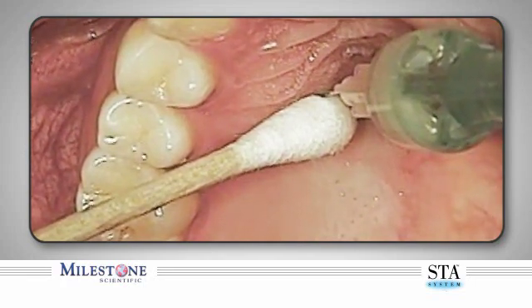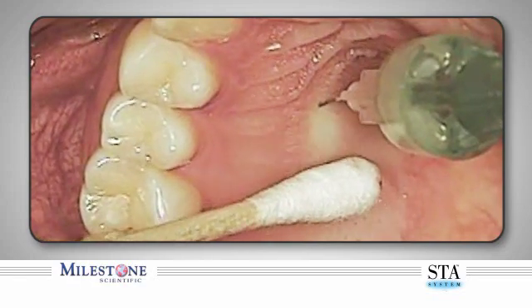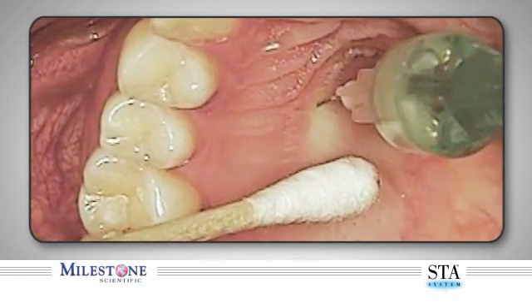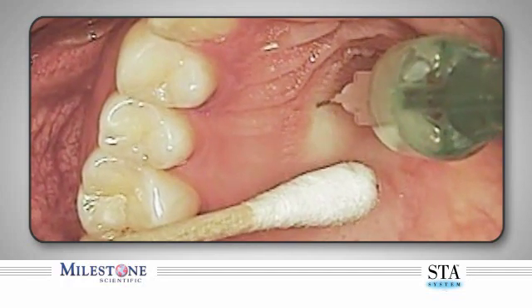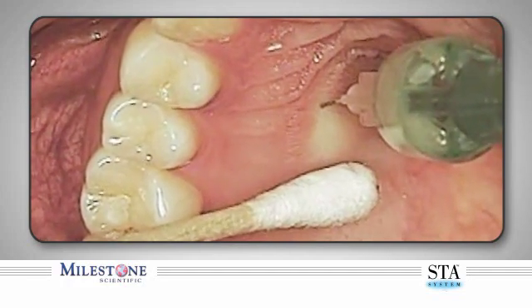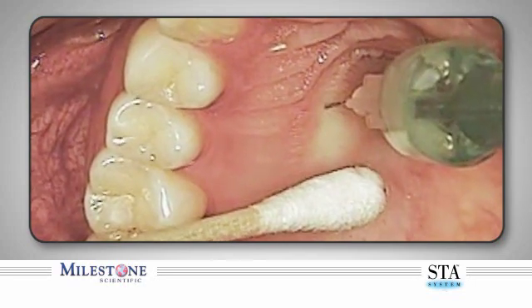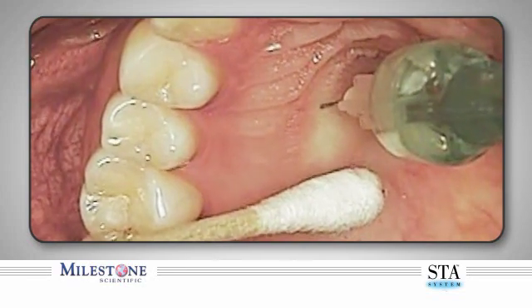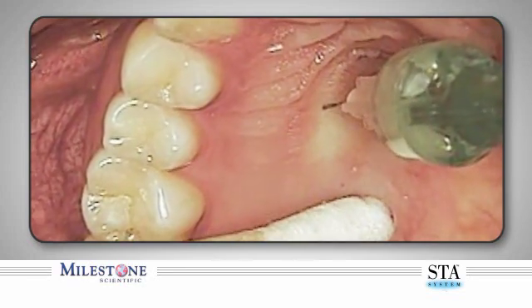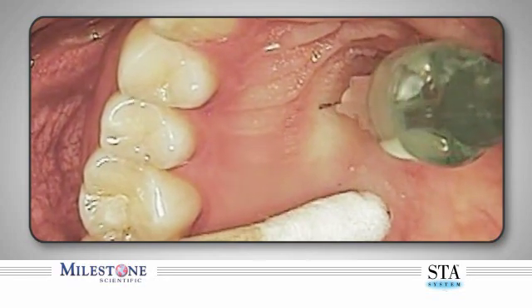Next, simultaneously advance the needle an additional one to two millimeters while rotating back and forth, which is subsequently followed by a pause in forward movement. You will note distinct blanching occurring in the palatal tissue, representing the effect of the vasoconstrictor within the tissues. This is normal and to be expected. All movements must be performed very slowly and gently. Do not move the needle more than one to two millimeters forward each time. Rapid movements are contraindicated.